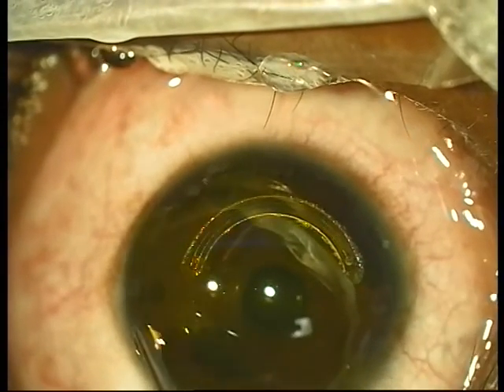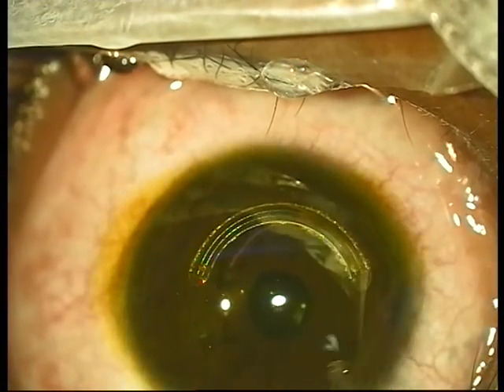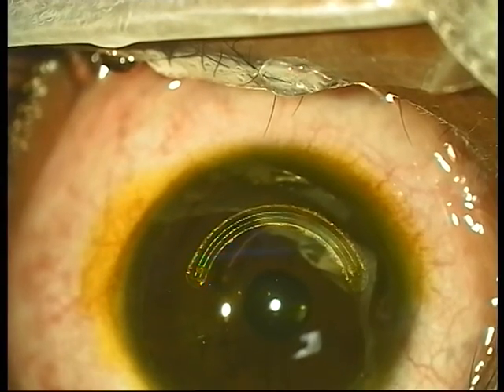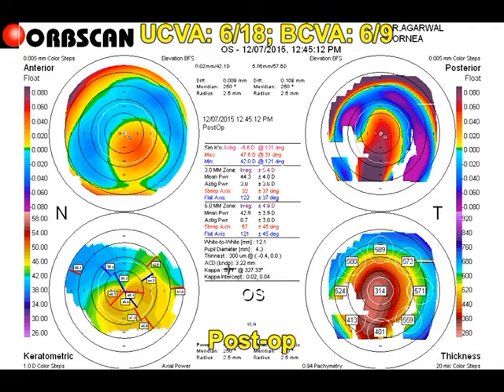The epithelium is then removed for the simultaneous cross-linking procedure. Once this is done, the cornea is soaked in riboflavin for 30 minutes, followed by cross-linking. We can see here the post-operative OPD scan at the sixth post-operative day.